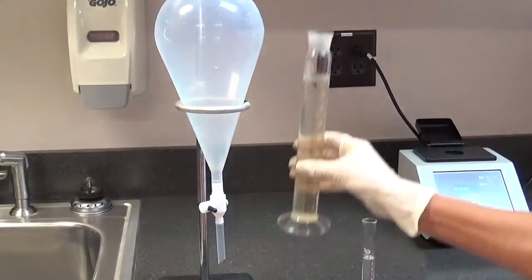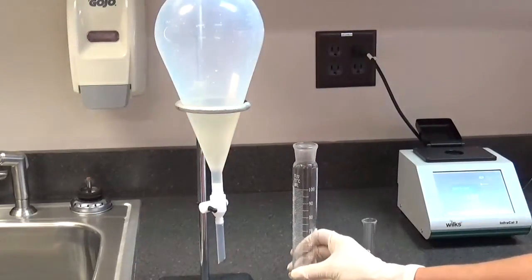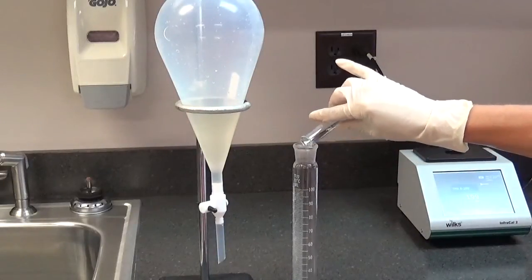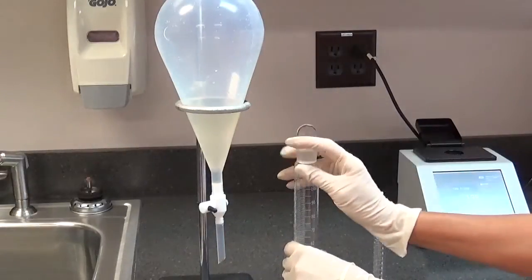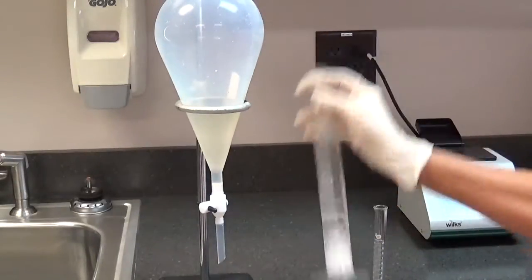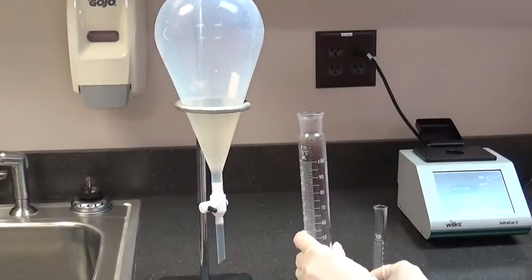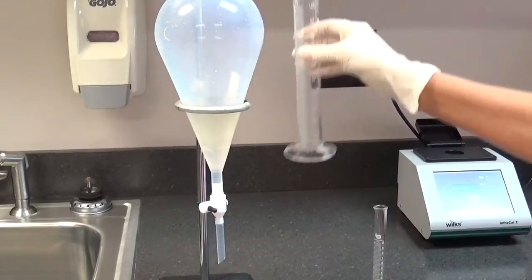Pour a measured amount of sample into the separatory funnel. Pour a measured amount of solvent into the graduated cylinder to clean out any residual oil. Shake and pour into the separatory funnel. In this example, we are using 100 ml of sample and 10 ml of solvent.